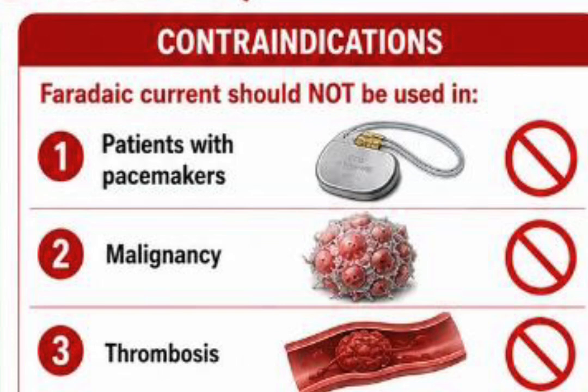activity. Don't use it for patients with malignancy, a patient with underlying maybe cancer or a tumor. Why? Because it could increase the spread of that, and it could increase abnormal proliferation of cells. Don't use it in a patient with thrombosis, a patient with already a thrombus formation in any part of the body, or maybe the patient is hypercoagulable. Don't use it for the patient because it could dislodge the clot and cause thrombosis. It could travel to the brain and cause some other conditions that you don't want.